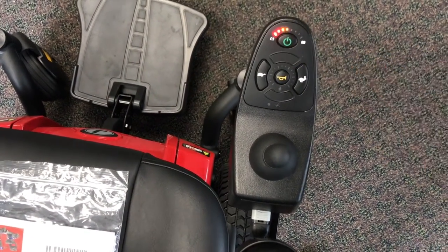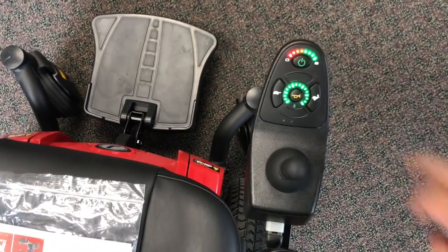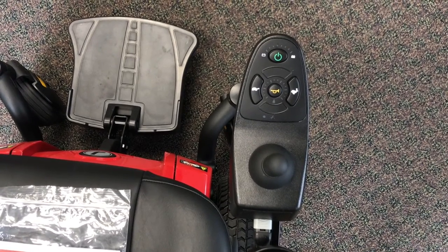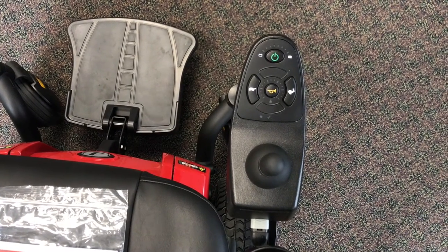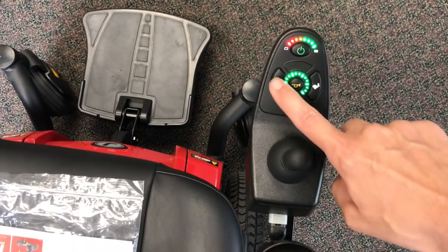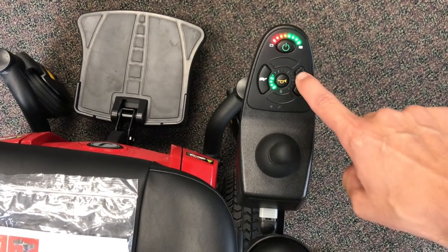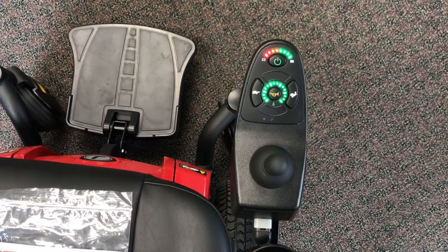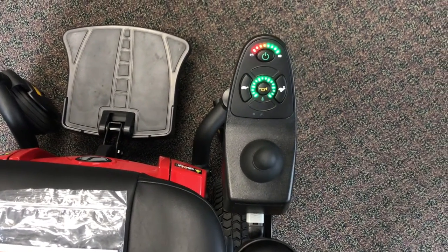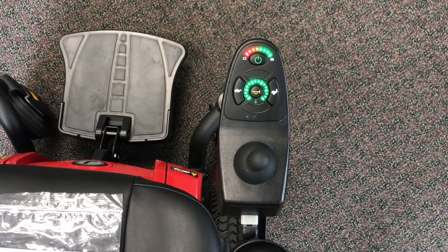Next is the joystick control. The top button turns it on and off — one press for on and one press for off. Once you turn it on, all the lights will light up. The top row of lights shows you how much battery you have left, and the middle row shows your speed. If you press the turtle button you will go slower; if you press the rabbit button you will go faster. And there is a little horn in the middle — it's more of a beeper, kind of sounds like a microwave, but there is a little horn on it.